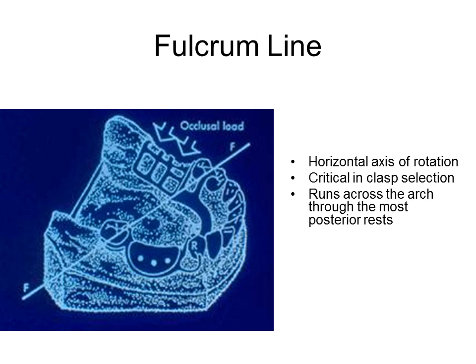When the partial denture is subjected to loading, elements of the partial denture on the extension base side move tissueward, whereas elements on the side opposite move toward the occlusal. Understanding this phenomenon is critical, yet simplifies the process of clasp selection.